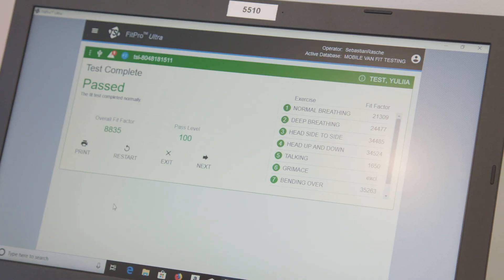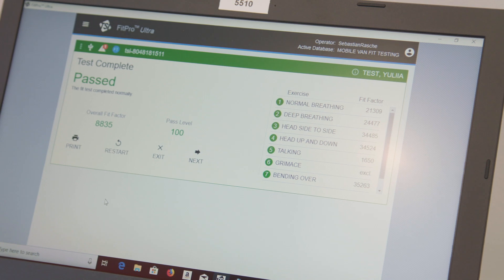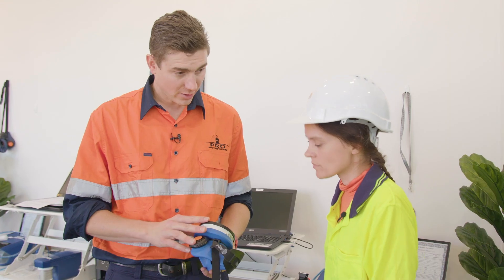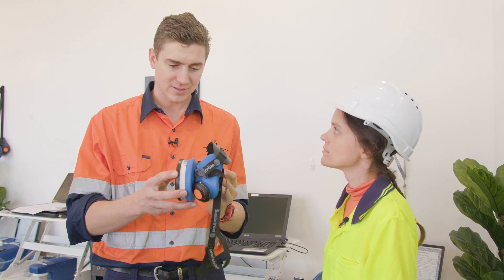Test passed. Overall you passed with a score of 8835, which is 88 times the pass level. So we know that you've passed on a small medium — a small medium will seal sufficiently on Yulia's face.